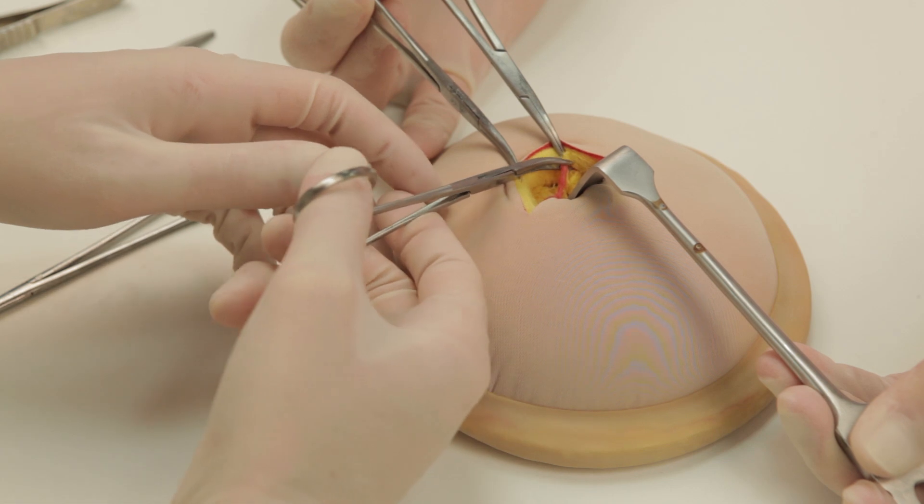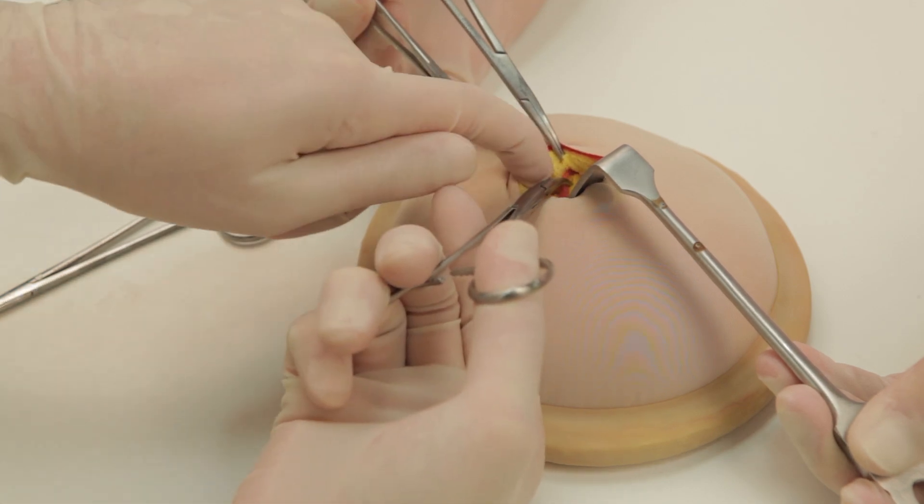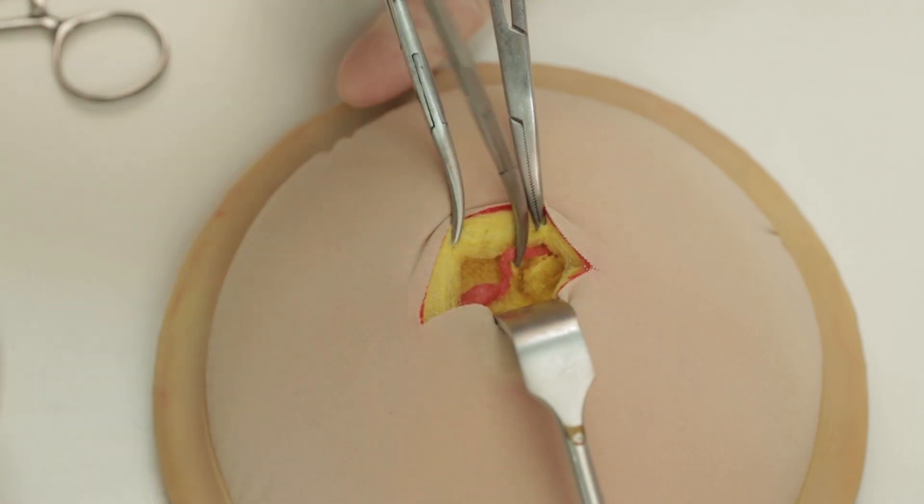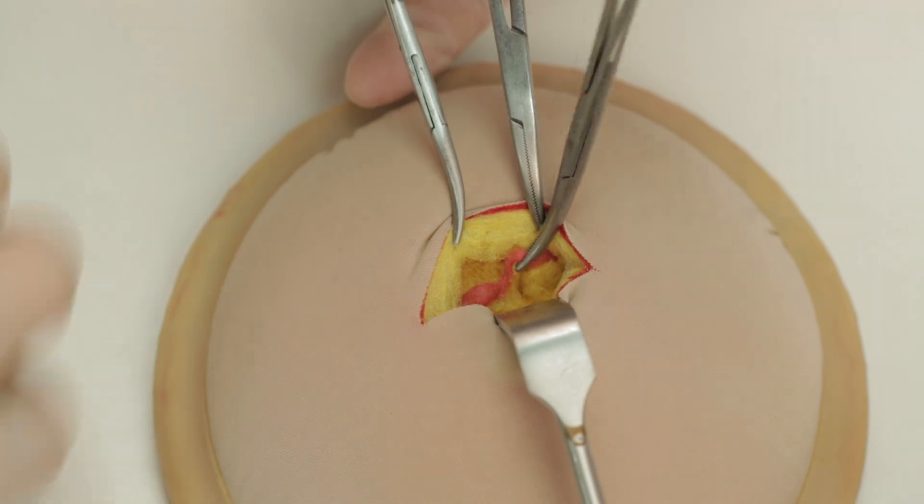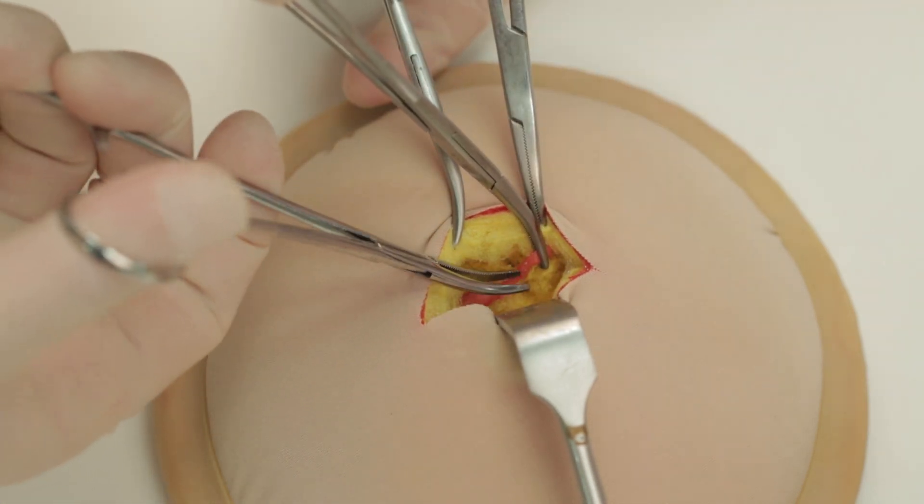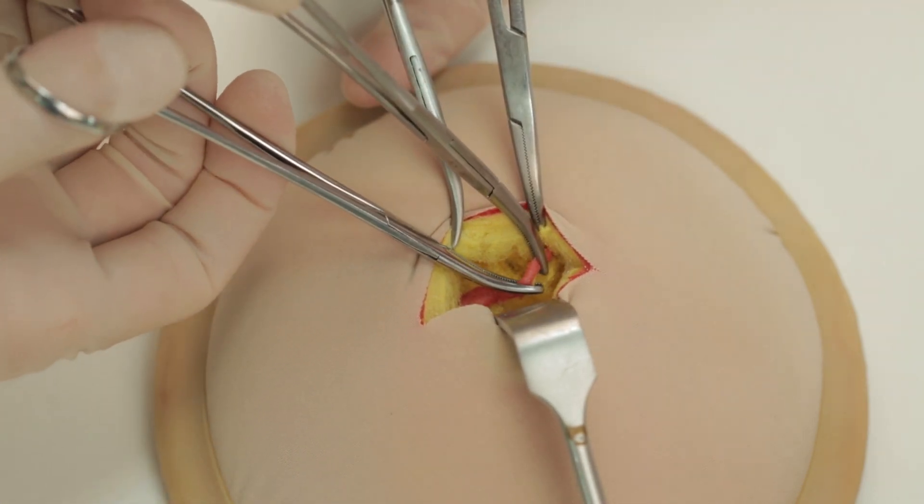Blood vessels should be ligated, either in continuity or between clips. Remember to spread the scissors along the line of the blood vessels to avoid tearing them.